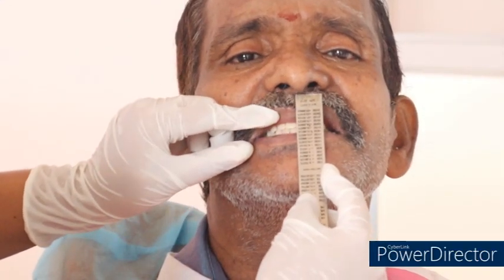The midline of the central incisor has to coincide with the center of the philtrum, and the midline of the upper central incisor should coincide with the lower central incisor. You can check this with the scale. So all the three are in the same line.